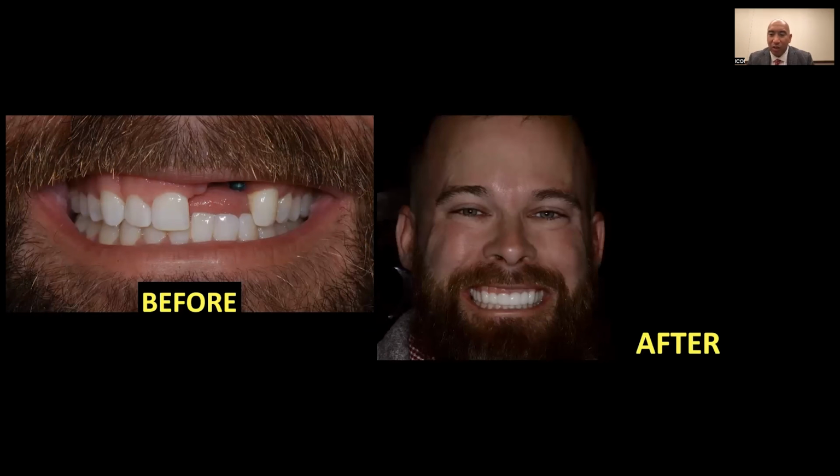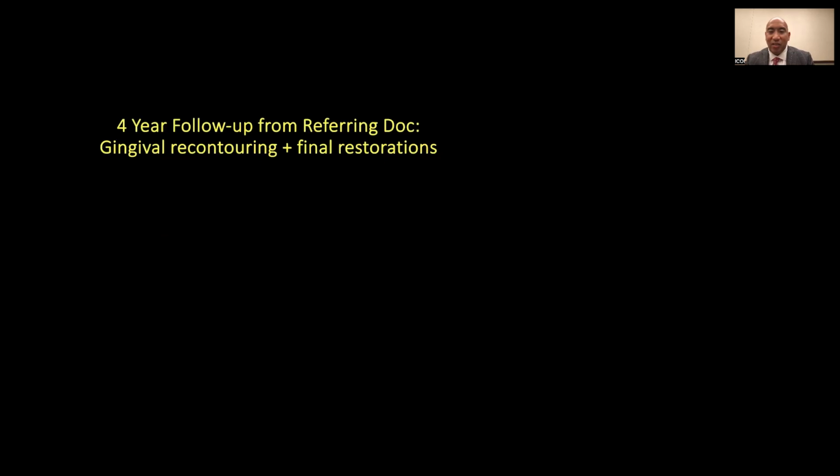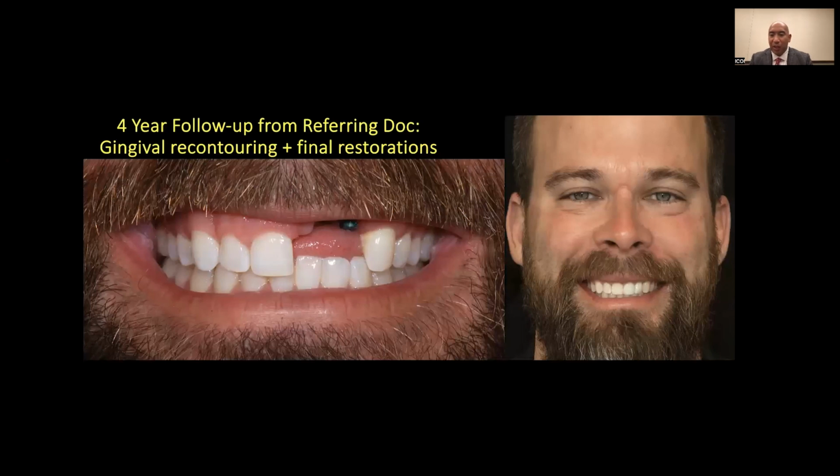I didn't like that. So fortunately, by the time his dentist sent me a final photo of him, he had done a little bit of a gingivectomy to get those teeth a hair longer so that his smile is restored. But anyway, you can see everything's looking beautiful. He's looking great. This is at 4 years. So I anticipate this to last a long while, but with implants, who knows? But we look good right now.